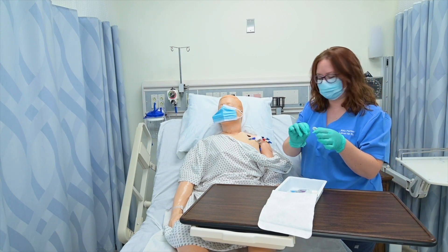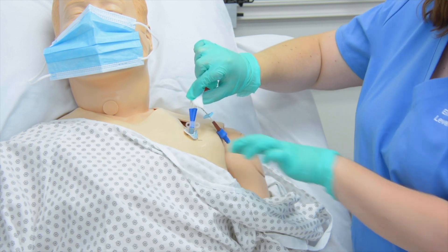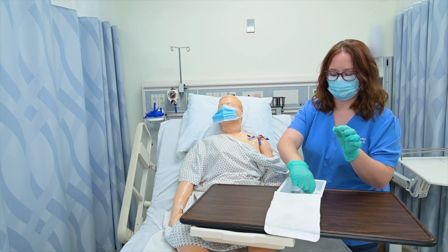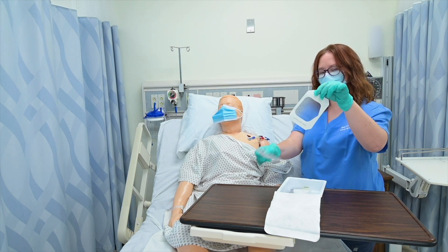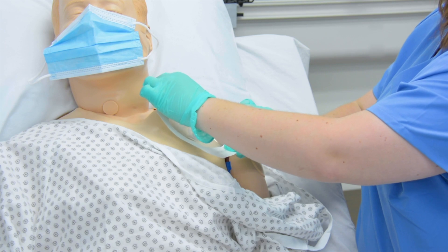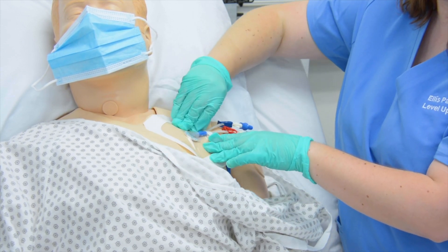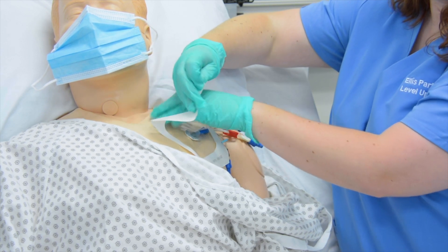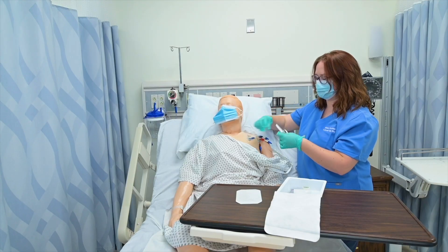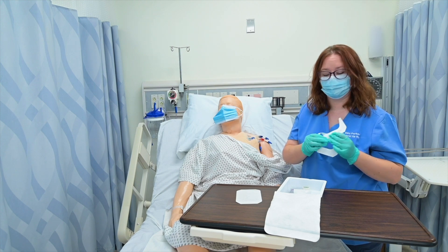I then get my antimicrobial patch if that's ordered, and I'm going to re-thread it around the site of insertion. I'm going to discard that piece of gauze. I then get my sterile dressing — there's a split in it that goes over the tubing. Press that down and take my wrapper off. Almost every dressing comes with a little sticker for you to fill out with your initials, the date, the time, and potentially the gauge of the catheter itself. So I would simply fill that out to complete my dressing change.